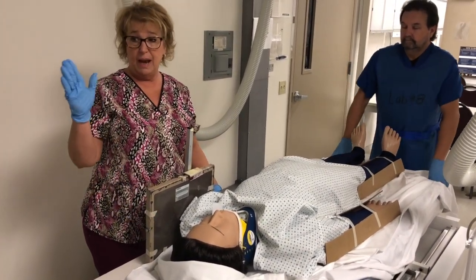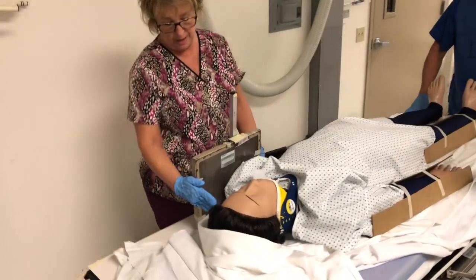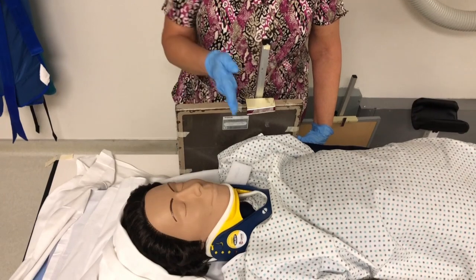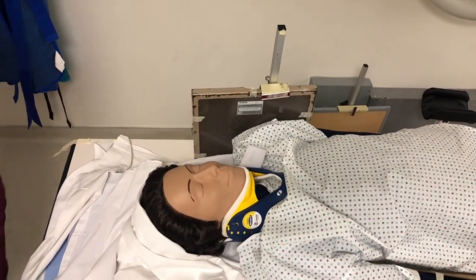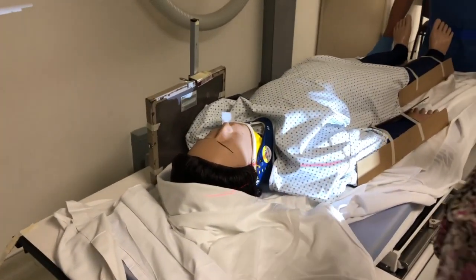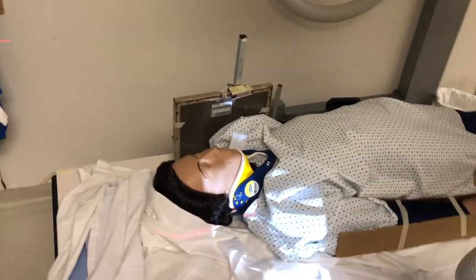So normally we would have our patient upright. In this instance, she's on a backboard. So we're gonna do this cross table, but we're still gonna keep the upper border of our IR at the top of ear attachment. I wanna see if the center is roughly about C4. I'm gonna try to get 72-inch SID, which in this situation is not possible, but I'll collimate.